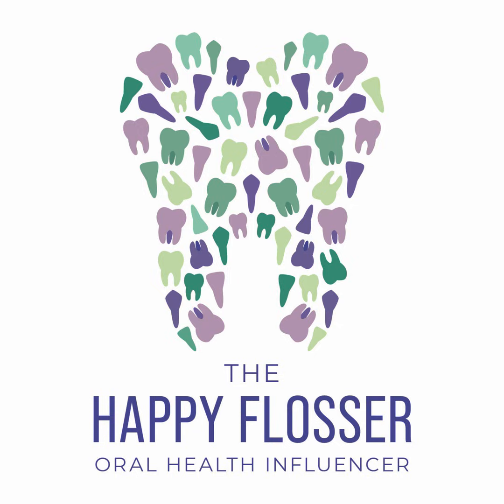Like, for example, things to evaluate on a radiograph would be tooth development and abnormalities, right? Eruption patterns. Is the eruption pattern correct on your patient? And is there a malpositioned or missing tooth that should be in the dentition based on the age of the patient, but it's nowhere to be found?